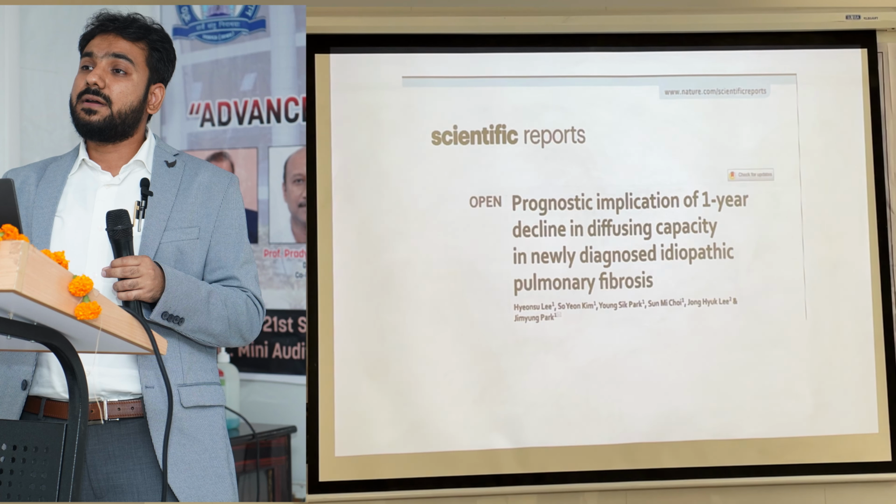If a DLCO is normal, can we say that the patient is not having ILD? Any disease where we can say that since the DLCO is normal, the patient is not having any disease? No. There is no disease which is diagnosed or refuted based on DLCO value. So it has two key components. The first is that a fall in DLCO can tell you about exercise capacity. If the patient has less than 50 DLCO, it is directly correlating with poor exercise performance of the patient. That is one thing, quality of life.